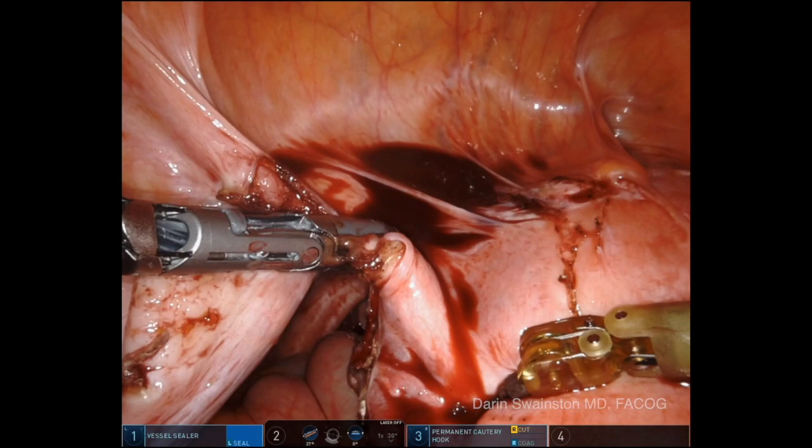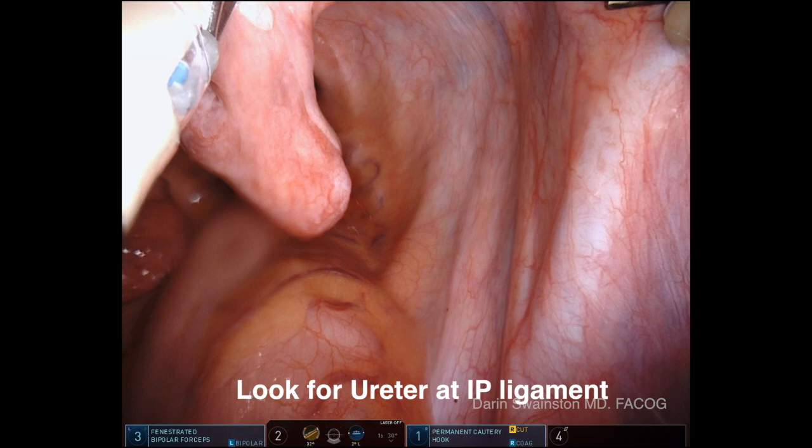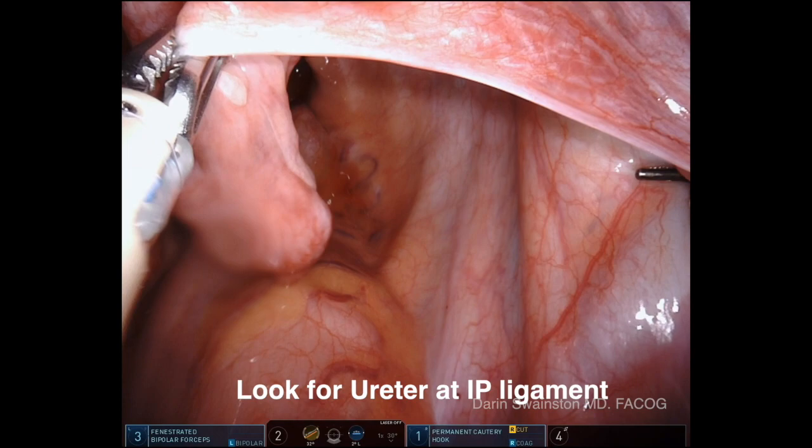And that's how simple this is using the vessel sealer hook. Notice I use that right hand to pull down — always use both hands. Know where your ureters are. You can see that the ureter is at the IP ligament there, very close. You want to know exactly where that is.